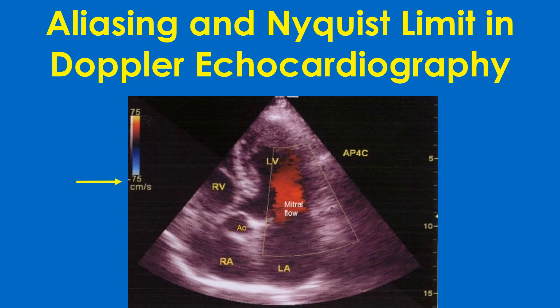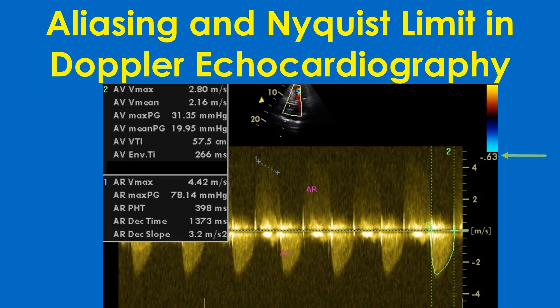In this image, the color bar is displayed on the left upper corner, obviously from a different machine. Both flow away from and towards the transducer have a Nyquist limit of 75 cm per second. Notably, Nyquist limits are different for color Doppler and HPRF Doppler even during a single imaging session.